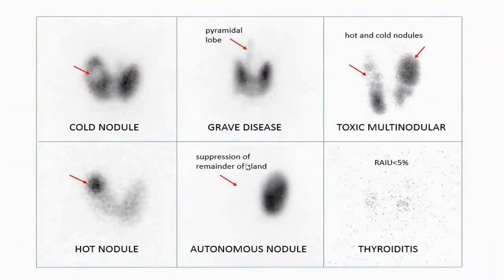Essentially, your count represents how many photons the crystal detects, irrespective of whether the energy is outside the spectrum or inside the spectrum. It doesn't matter to you.